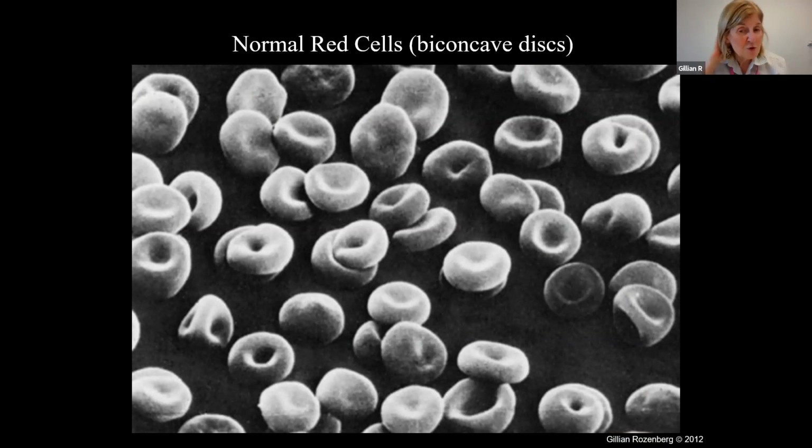The book was produced in 1975, and it's a very beautiful book that just gives you the electron microscopic picture of red cells and how they look. It makes it much easier to correlate the electron microscopic picture with the image that's been taken under the light microscope.